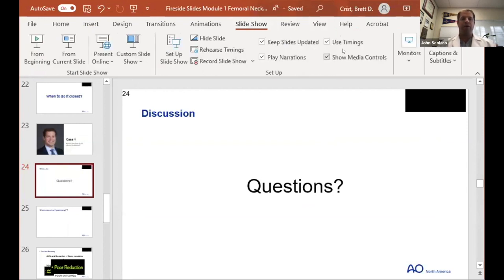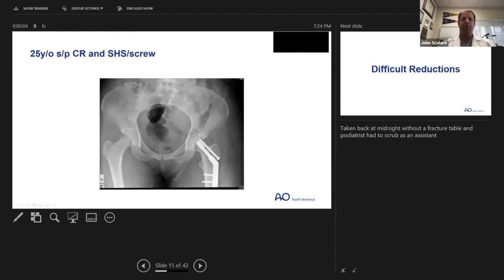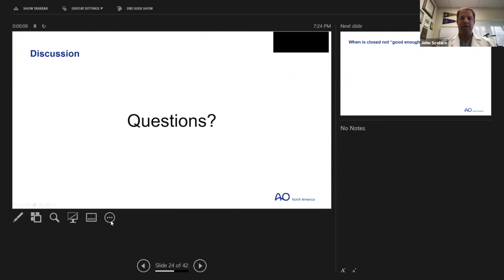Again, while it went along the midpoint of the femoral neck, it was going posteriorly, where I knew there was comminution from the ballistic injury. So primarily it was based on fracture pattern. If I have a fracture that has nice clean edges, fractures like compression, so I don't like to utilize fully threaded screws when there's no comminution present. In general, that's just a general answer for my technique.